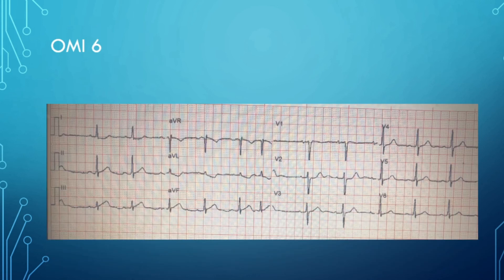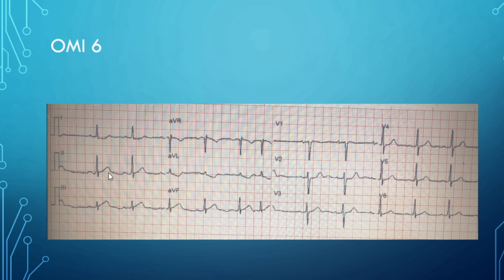By the end of this lecture we should be pros. The inferior leads show hyper-acute T waves and there's a flipped T wave in AVL. Lead 3 especially is very hyper-acute — shooting right off the QRS complex, becoming more symmetric, with a wide base. The T wave is massive relative to the small QRS; you can almost fit the QRS inside the T wave. AVL, its best friend, shows a flipped T wave. It's going to be an inferior wall MI.